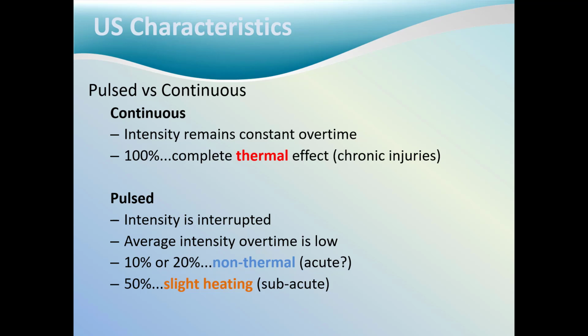The total amount of on time may be 10% or 20%, which will result in a non-thermal, or maybe more accurately, a minimally thermal treatment. These non-thermal treatments may be used with acute injuries. A greater duty cycle of approximately 50% will result in slight heating effects, which might be appropriate for subacute injuries.